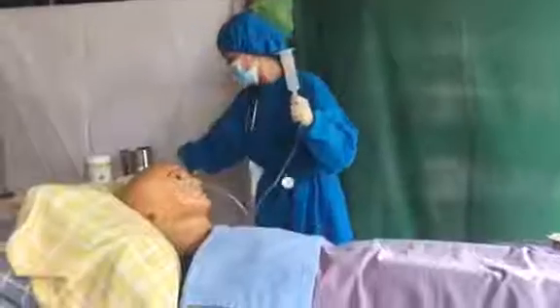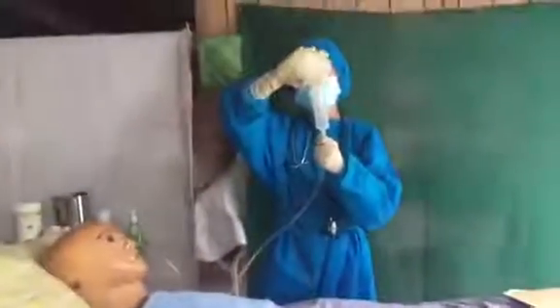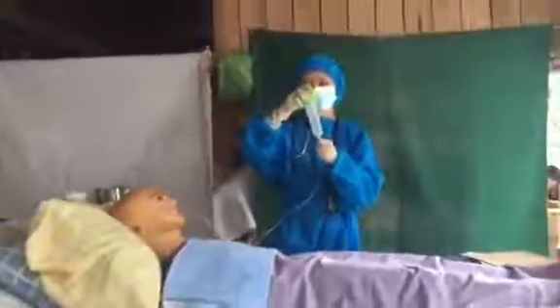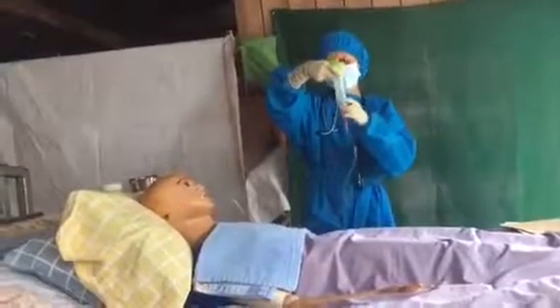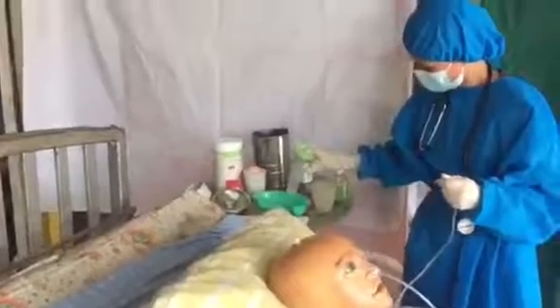And then again, introduce 60 cc of normal saline and put back again the valve and then press and let it backflow. Then lock the tube and remove the asepto syringe and pump the gastric contents into the kidney basin.